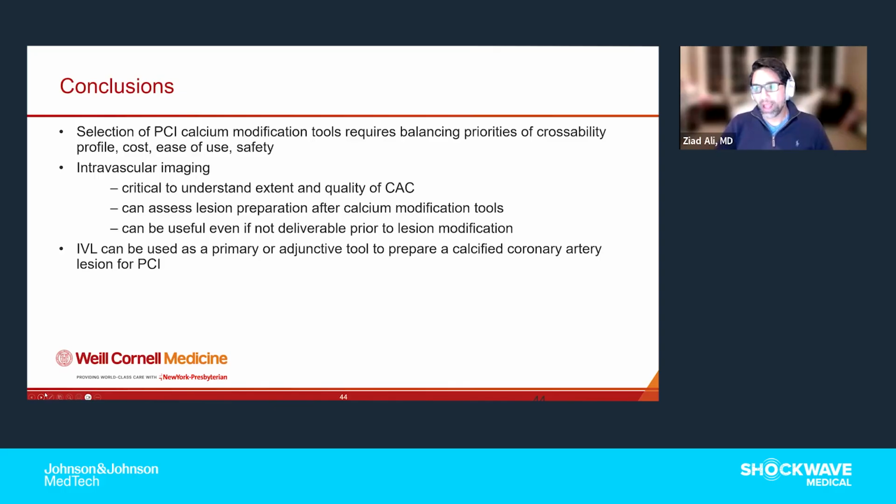And so what ends up happening, at least for OCT, is, if you think of this like a crystal, and you get a crack in the crystal and you shine a light through it, unless the light goes through the crack and creates a refraction of that light, you won't see it. It's almost like an ice cube or a crystal. You packed it together, the light has no refraction, you won't see it. And so we missed 50% of fractures by OCT. As a result, we realized that the balloon was a better marker of whether you're prepped, like you quite astutely and eloquently do, and look around in multiple views.